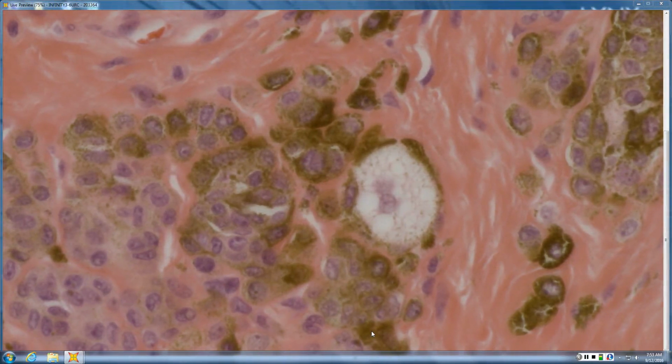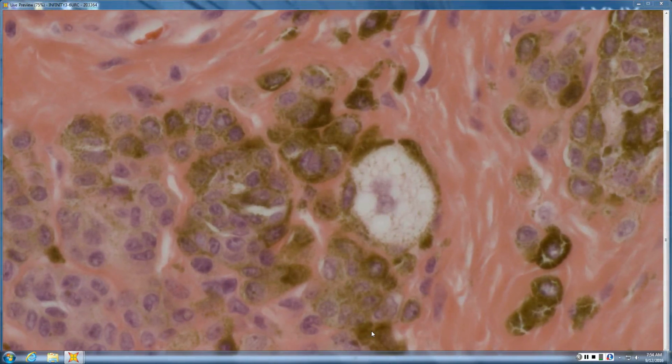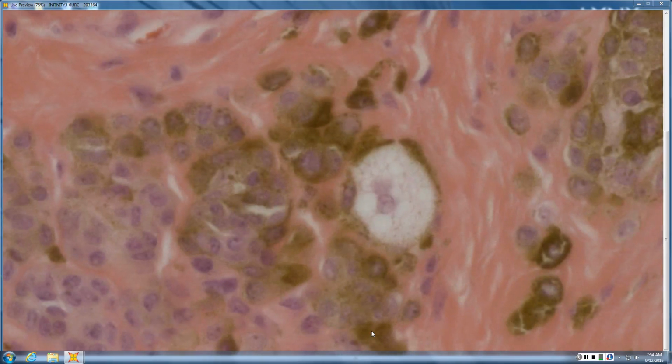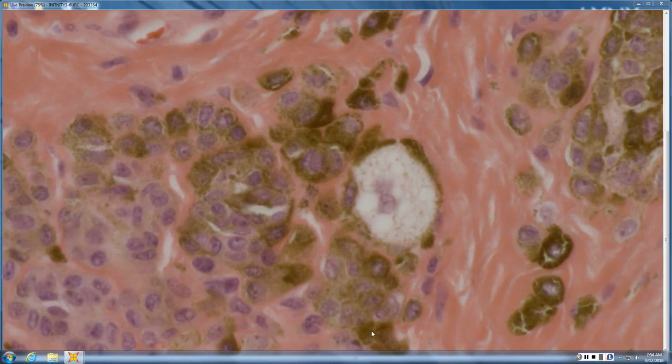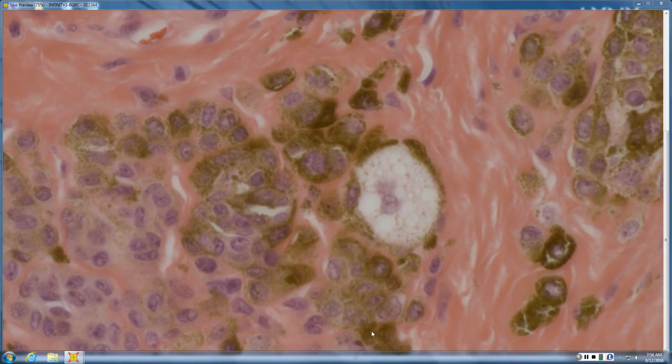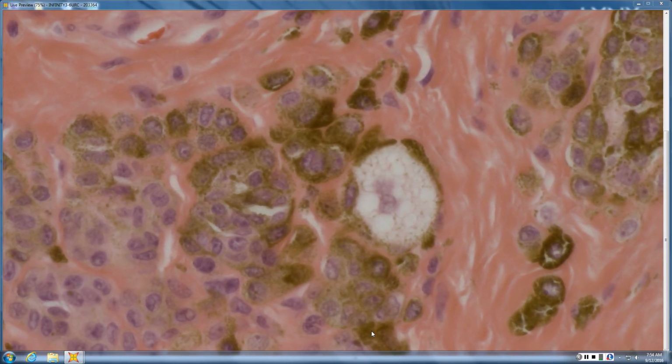People have quipped that this is, quote, a nevus sebaceous, which has nothing to do with nevus sebaceous, but it's completely benign when you see it. Actually, that's not what I meant to say. What I meant to say is it's meaningless when you see it. You see it in nevi, you see it in melanoma. It doesn't tell you malignant or benign. It's just something that happens in melanocytes, in any melanocytic lesion. So that sebocyte-like change means nothing.